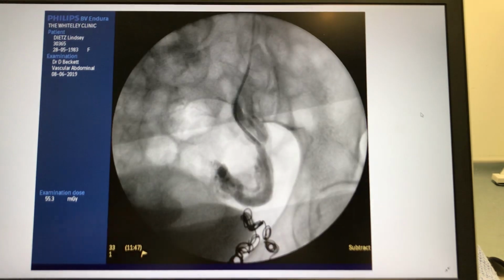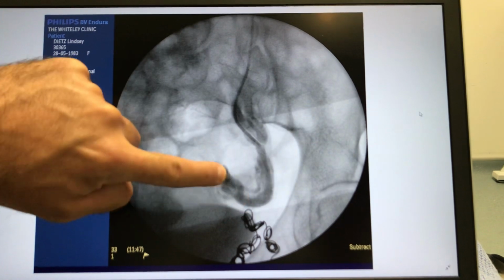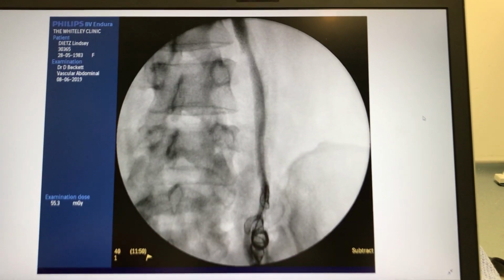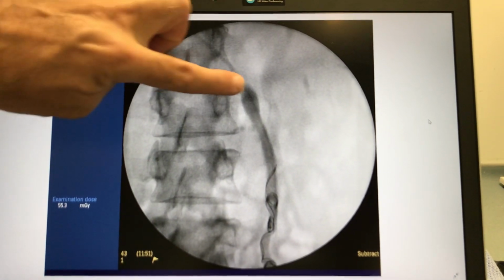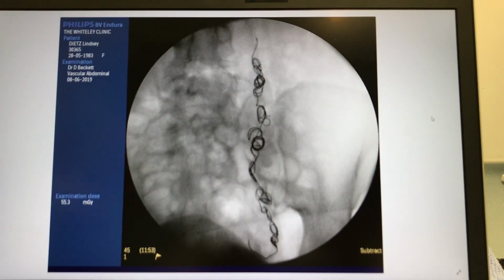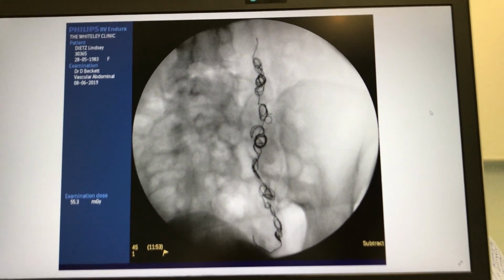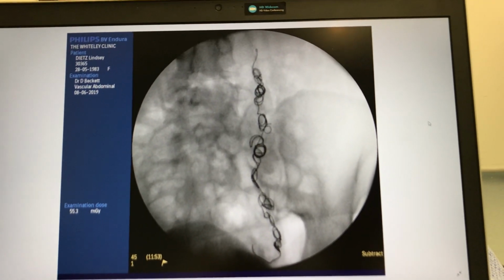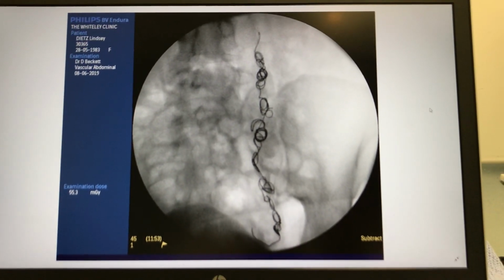Right. Wow. And then more distally, this is your left hip. And this is down in the pelvis again where I've got the catheter. So we've then put in a coil there. So we're blocking that whole vein, and this is midway along the vein. And again, we put a coil in. This is the top of the vein here. And then right at the end, that's showing the full length of the vein that we put the coil in on the left. So the order of the images goes all the way through to that. So it's a nice little story that tells you where I started on that left-hand side, blocked the veins, moved on to the right side, blocked those veins, then moved up into the tummy, blocked the ovarian vein.